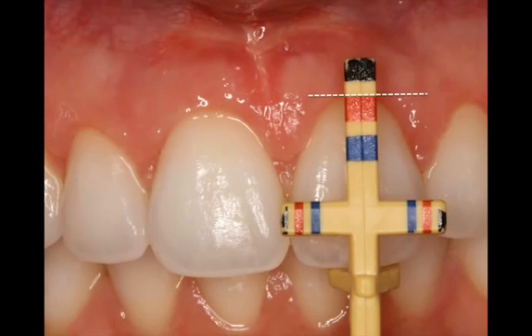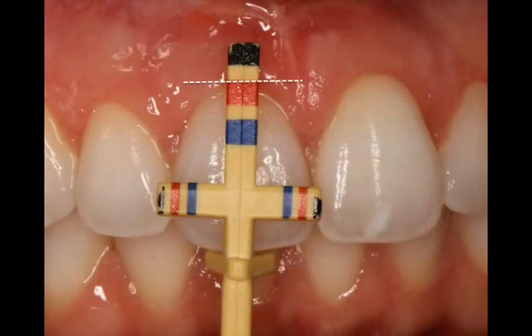Now, I went back and with my proportion gauge, I wanted to see how I did, and I'm looking at number 9. The width of the tooth is in between those two red lines, and the height of the tooth is all the way to the red line. So we have proper tooth proportion. And how about number 8?